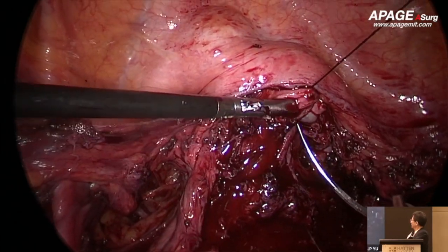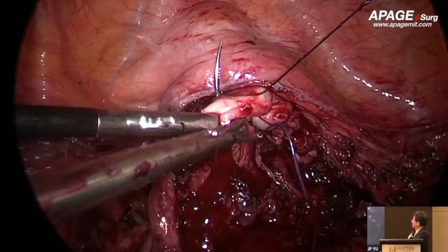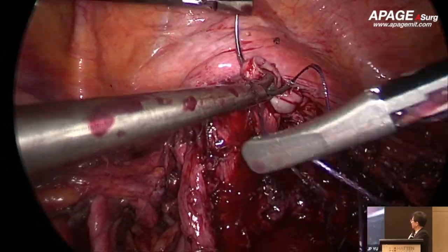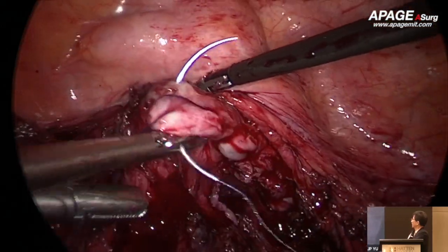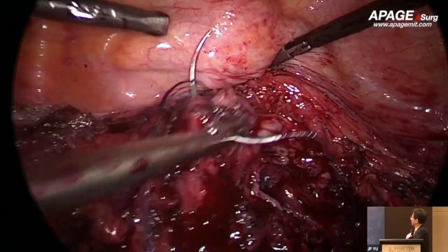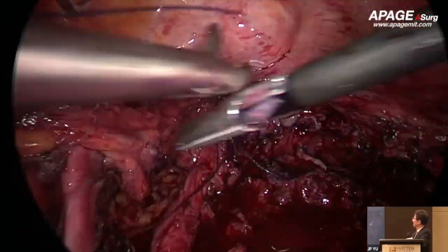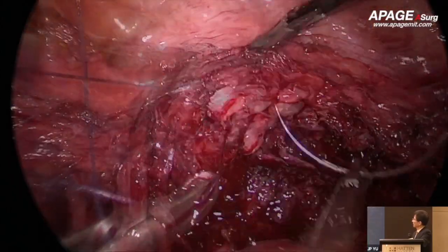So we can find the ureter here. We directly suture from the laparoscope, the involved ureters are identified, and all the lesions just beside, on the pelvic sidewall, have been dissected away. So the space is quite clear. So the principle of the radical surgery is just the same as endometriosis surgery.